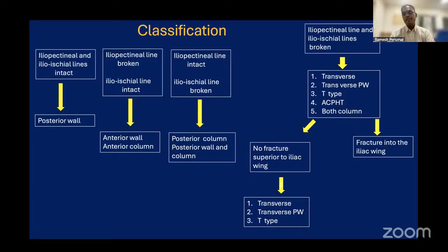When the fracture line is extending up to the iliac wing, whereas at the level of the tectum we have three options, here we have only two options. You have to look at the posterior column. When there is a low exit of the posterior column, it is called an anterior column with posterior hemitransverse.